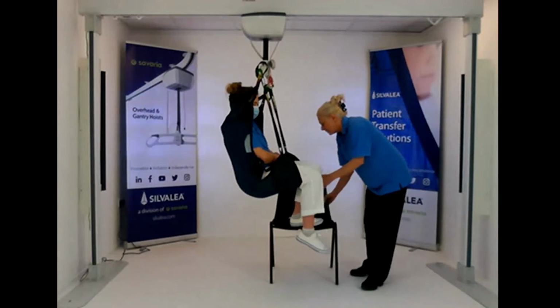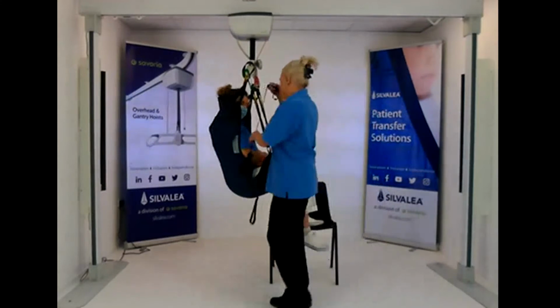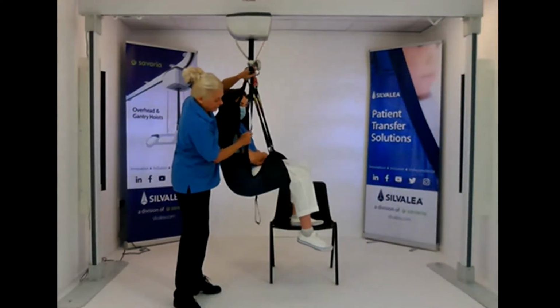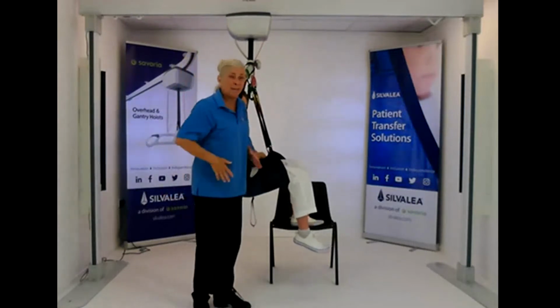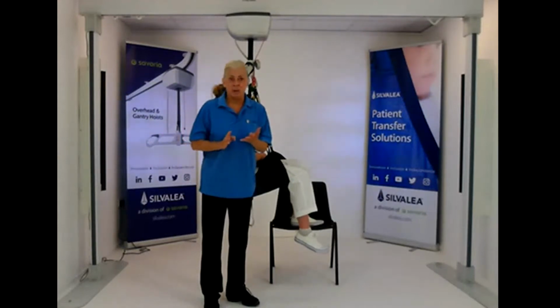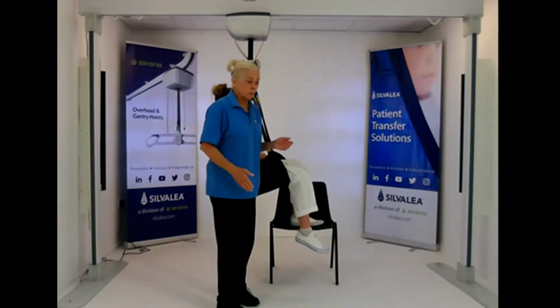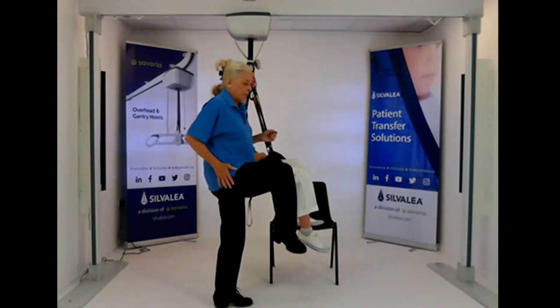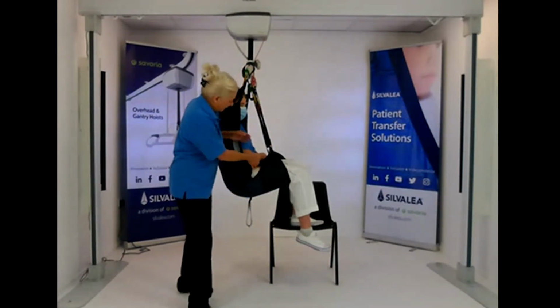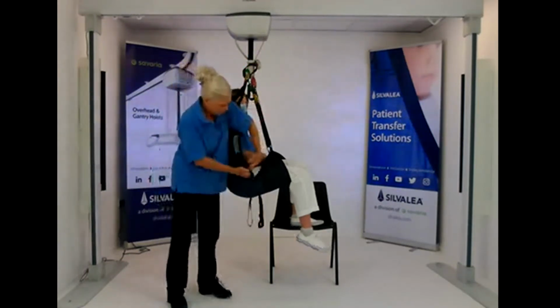Just put your foot on there, spinning. And then I've added in this scenario a hip tape. Hip tapes will help to lift the hip, which is really helpful if you've got someone that's got painful joints, arthritis, osteoporosis, more fragile, brittle bone type scenarios where you need lots more support. It will help to lift that area, distribute the weight, and it takes pressure from behind the knee. So a hip tape on this style is really beneficial. And they usually are detachable.